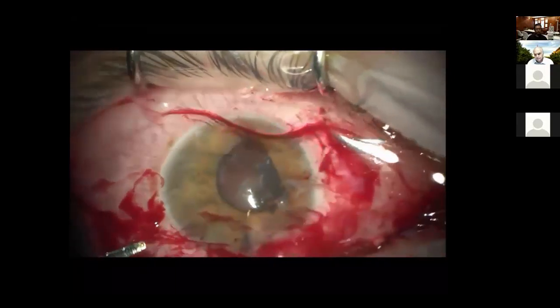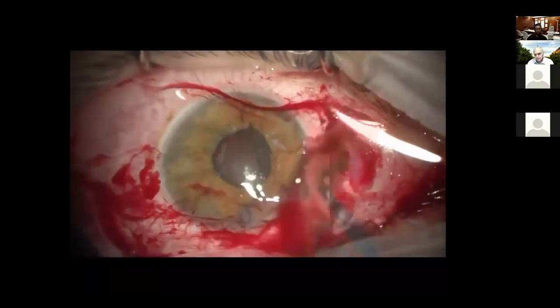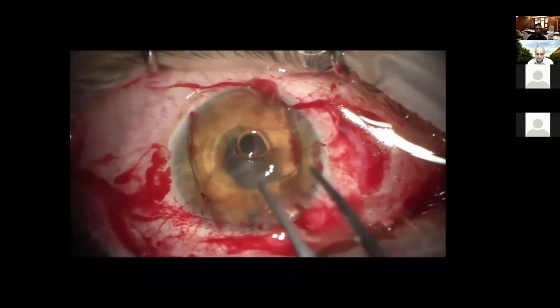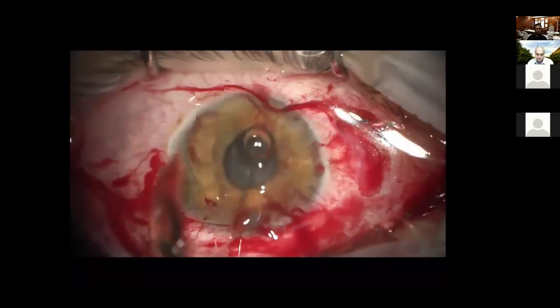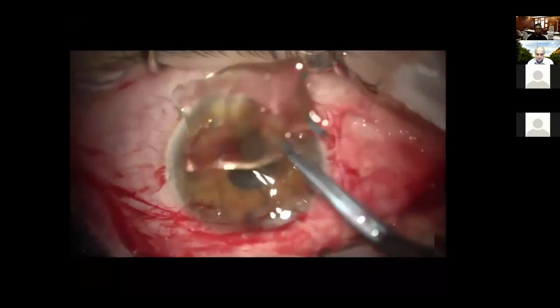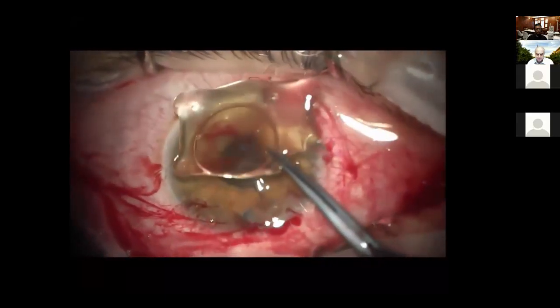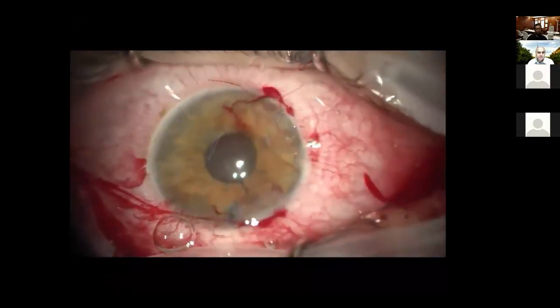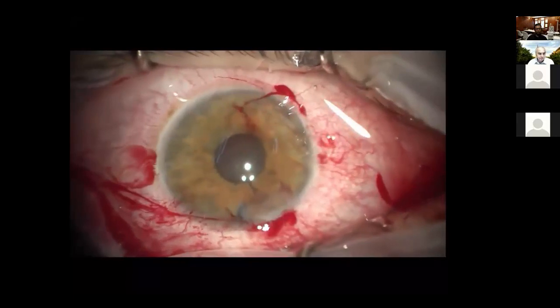And as you can see here, it's being pulled out through the same incision. I'm showing the lens here. Part of it is torn, of course, due to the previous cut. And the whole lens came out through this small incision. And this will allow me to perform my regular phacoemulsification safely. There is a peripheral iridectomy that was made here because of the previous surgery.